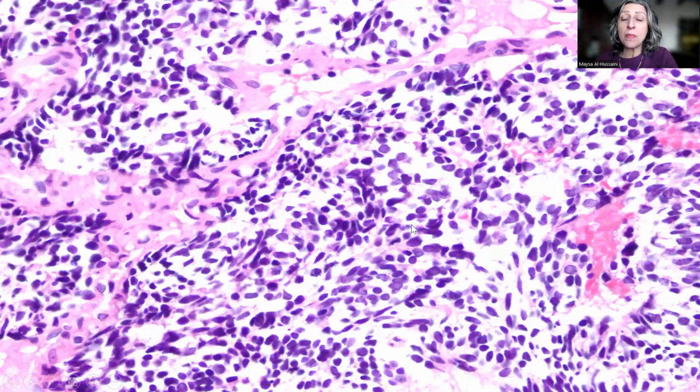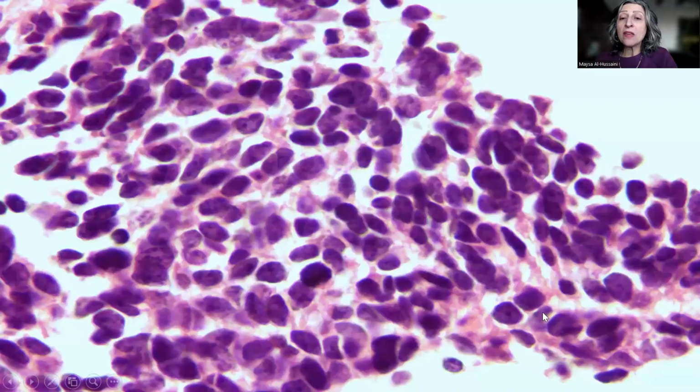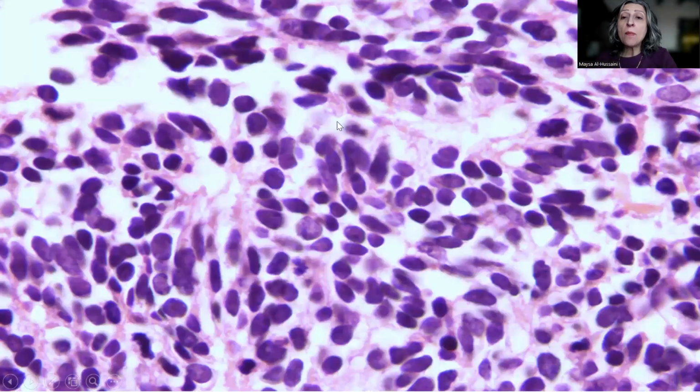tumor. On high power magnification, as you can see, there is total replacement of the bone marrow by this highly malignant small round blue cell tumor that focally showed a tendency at rosette formation. On higher power magnification, there is a very high N/C ratio, abnormal forms with an oat-like appearance of the tumor cells, and some apoptotic cells here and there. And this is high power magnification of the area where we have some tendency at rosette formation.